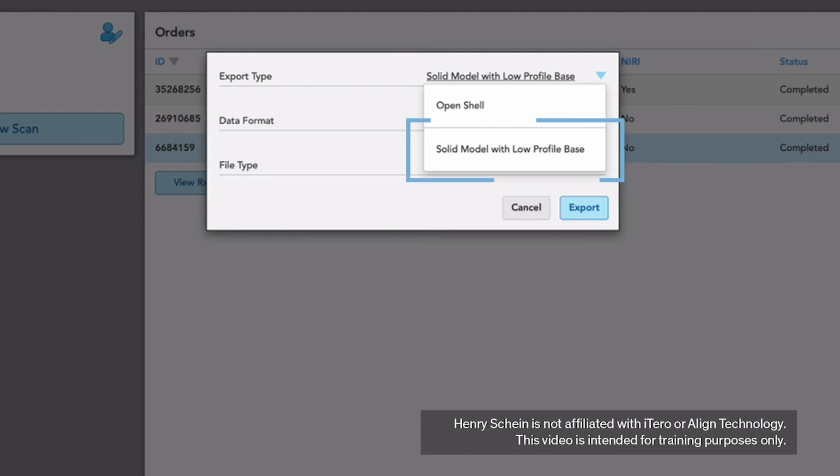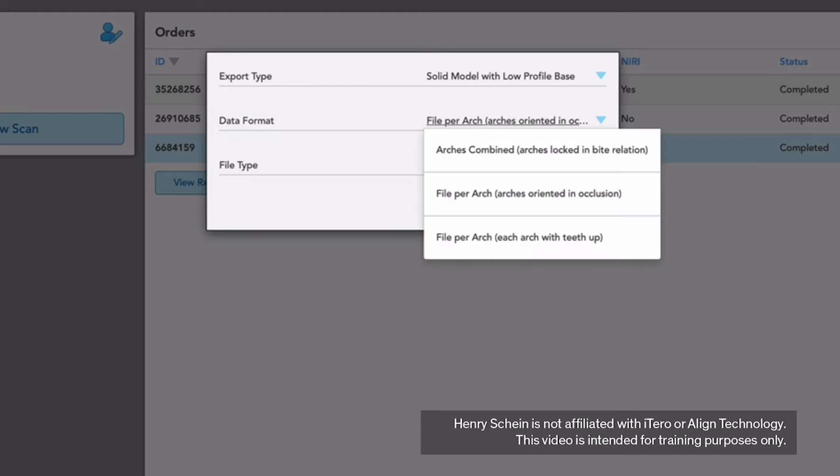Export Type: Choose Solid Model with Low Profile Base. Data Format: Choose Files Per Arch, Arches oriented in occlusion.